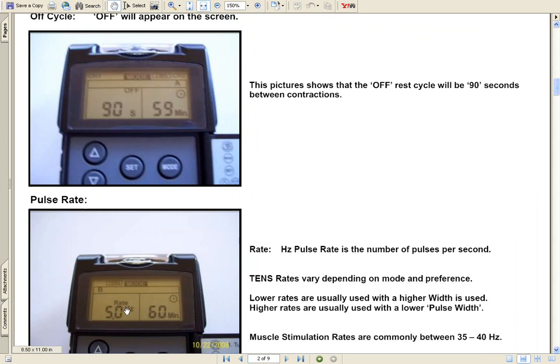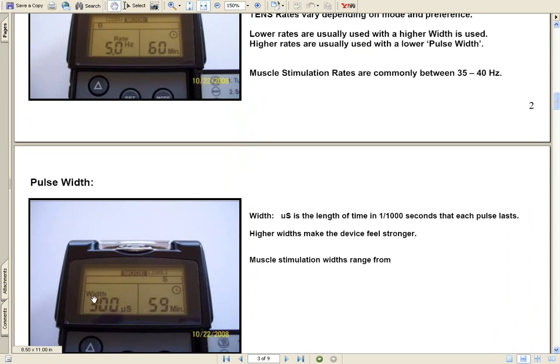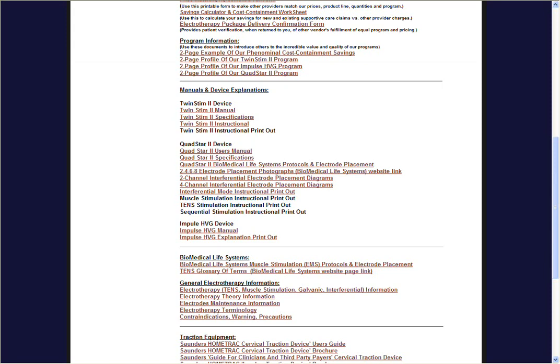Pulse rate, see pulse rate or hertz would be on the screen. Pulse width, with the tutorials it will show you how to change these parameters, and then the timer, how long you want the treatment to be. So that's pretty much the explanation, a general explanation of muscle stimulation and how it works. If you have any questions, just review the manuals, review the documents, review the tutorials, and I really hope that you get the best results from our company and our products and equipment, and wish you the absolute best in your treatment program.